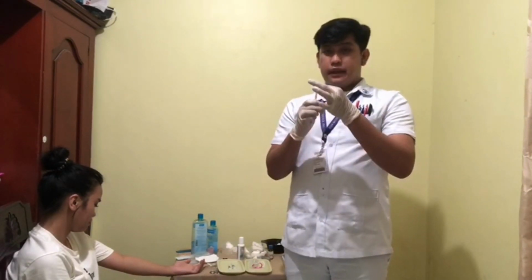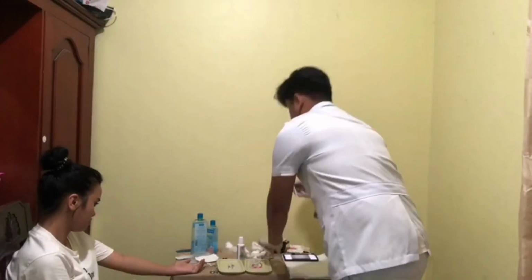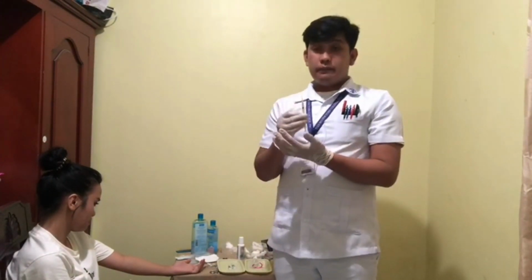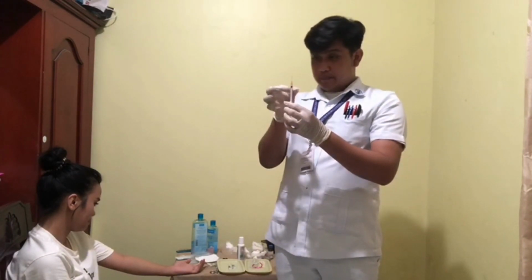Then we'll now remove the needle cap and make sure it is not contaminated. After that, I will expel the air bubbles from the syringe. This makes sure only liquid medication will enter the body. I am going to tap.